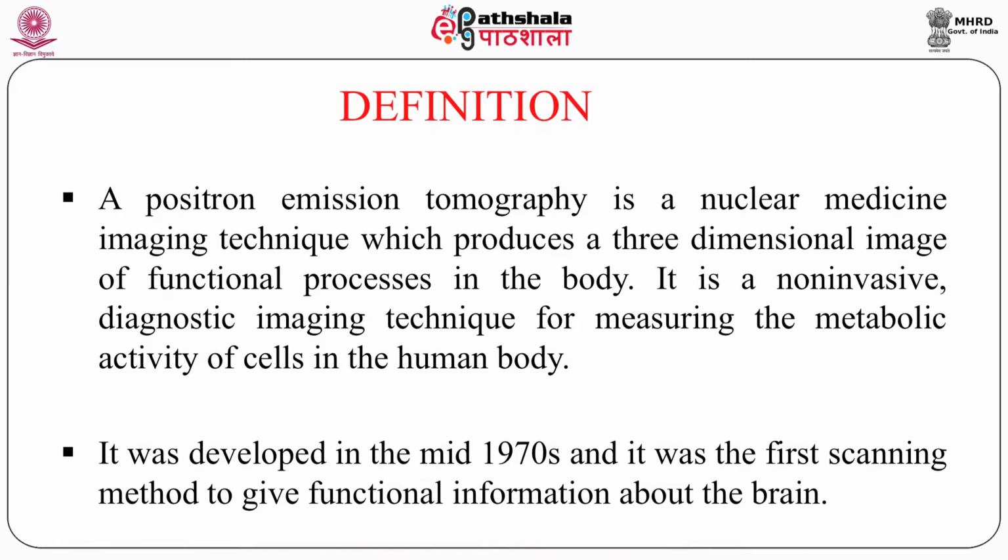It is again a non-invasive diagnostic imaging technique for measuring the metabolic activity of cells in the human body. That is the reason the things which we cannot detect at organ level or tissue level, here we have the chance to detect at a cellular level. So this is the imaging technology of today's era.